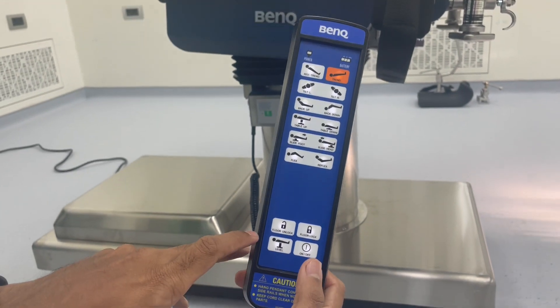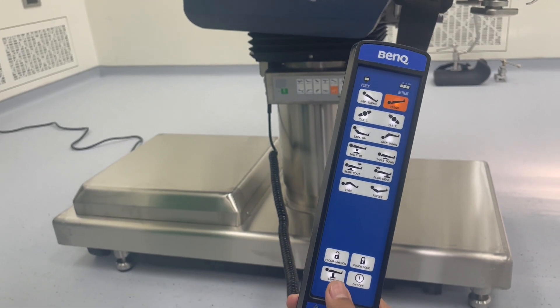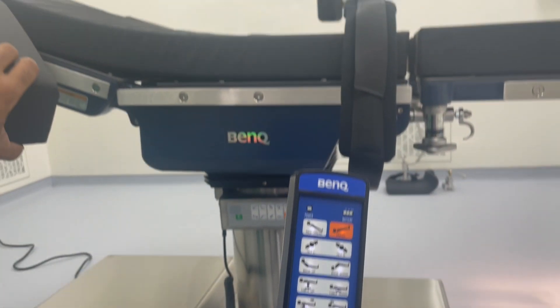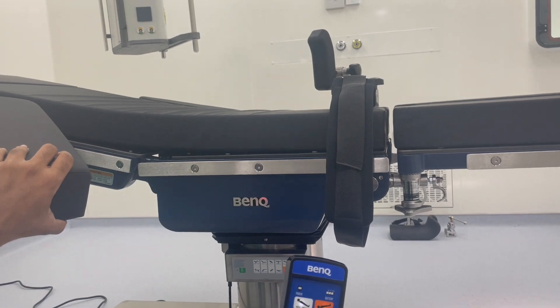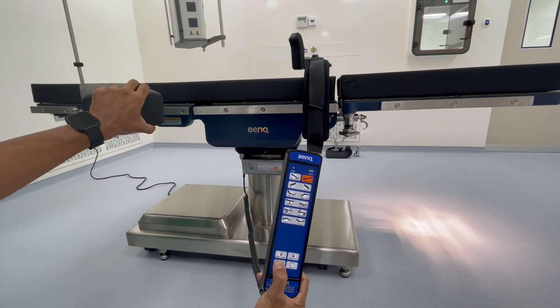If the patient is positioned in some trend, reverse trend, or tilt, you can just press the level button and the table will come into zero or supine position. Continuously hold this level button until the table comes into the zero or supine position.